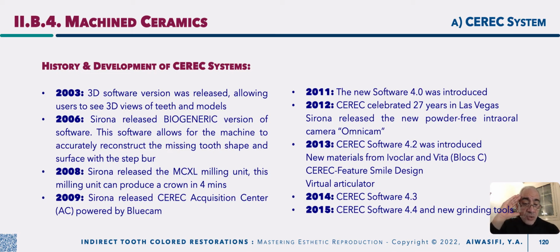Then in 2013, CEREC software 4.2 was introduced that allows the construction of restorations from different materials, including Empress and Vita blocks. Okay, the software allows for smile design and applies a virtual articulator to examine your contact, contours and anatomy from different directions, similar to if you have a live articulator.